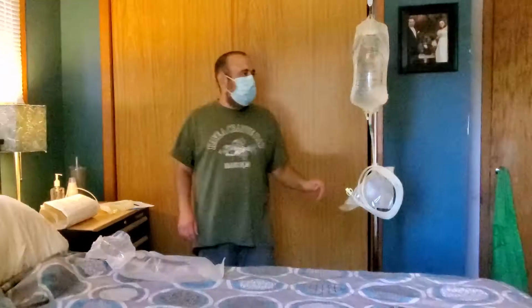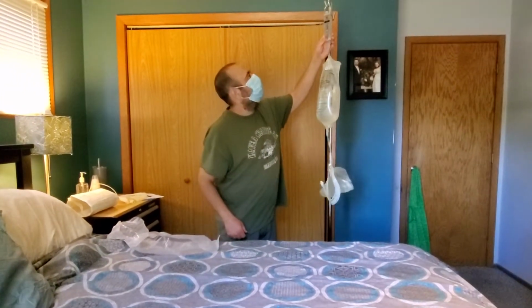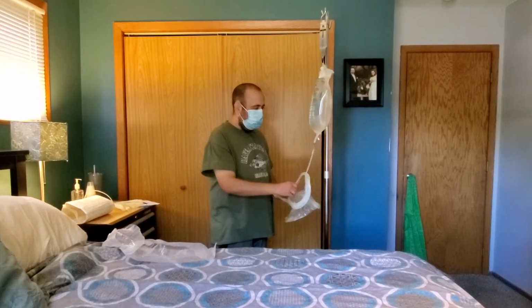Next step is to hang and measure the weight of the bag that's on the pole. This one's just over 2,000 grams. And then pull the drain bag off and separate all the hoses.